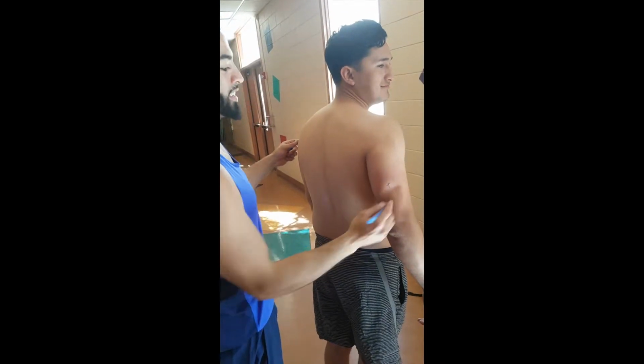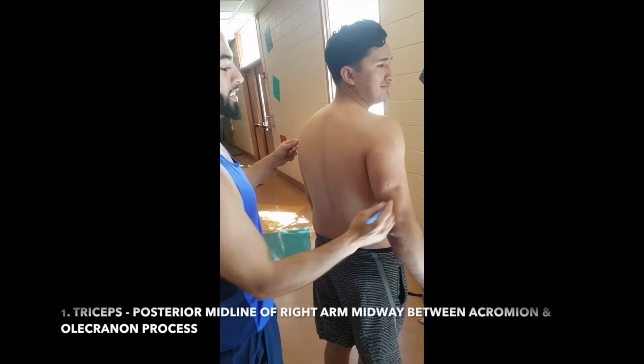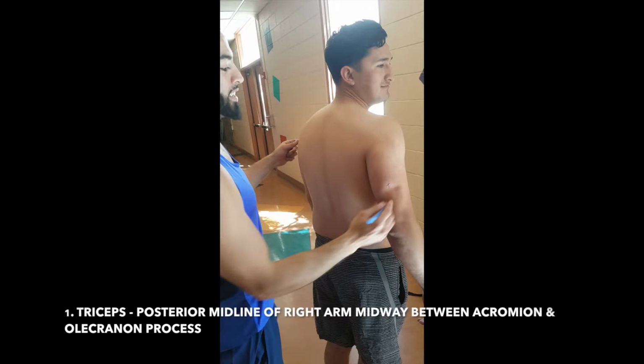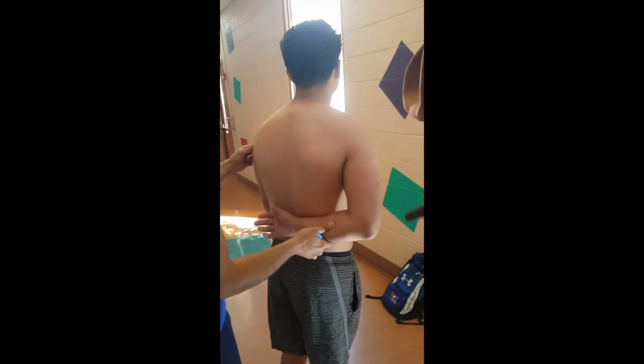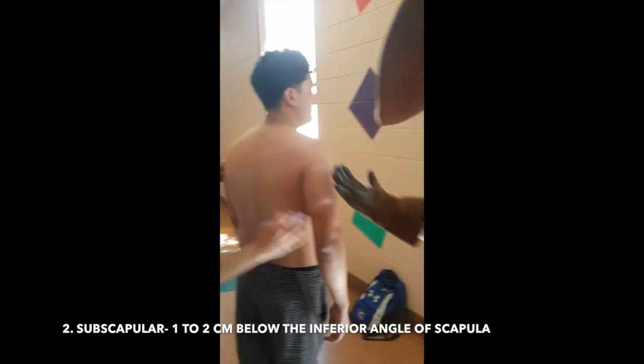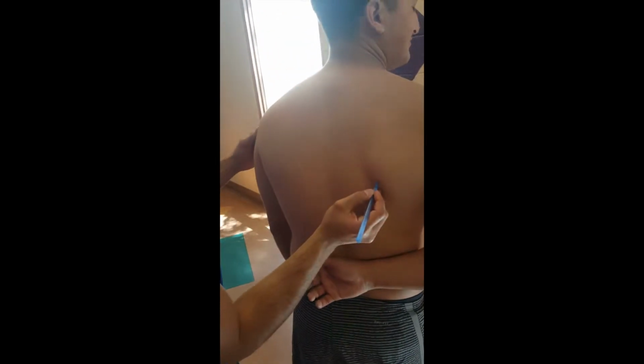We will start by marking our 7 sites with pen. It is important that the client is nice and loose and not moving or tense. We will begin our rotation of measurements with the triceps, which will be located midway between the acromion and olecranon process. Next, our subscapular measurement 1 to 2 centimeters below the inferior angle of the scapula.